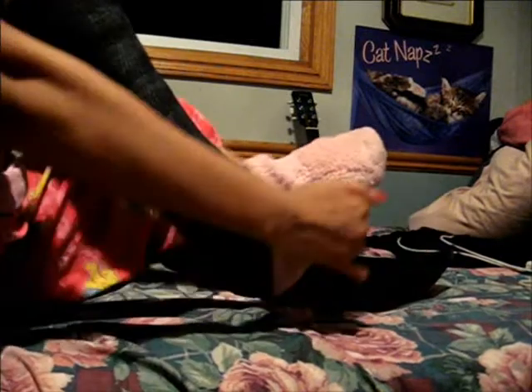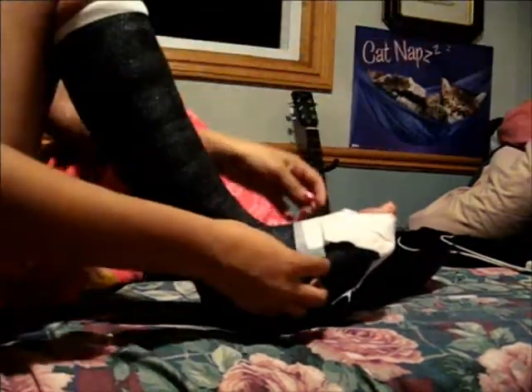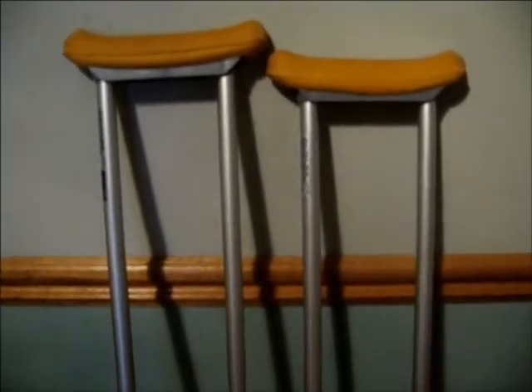This part is also pretty important — you just don't want that sock to touch your toe because it's really sensitive after your surgery. Here's another shot of my crutches before I show you how to walk with them.